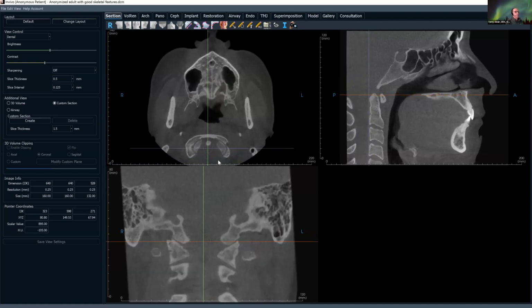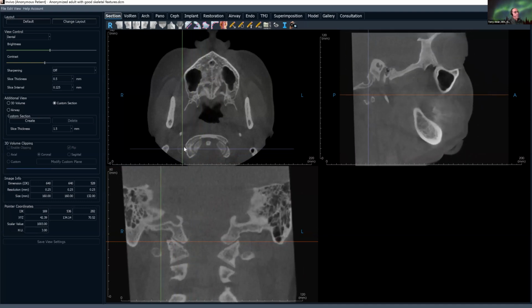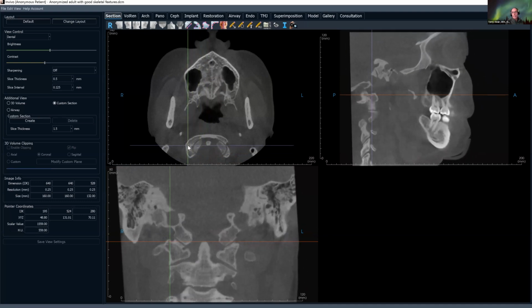And then one last look, I am going to grab these crosshairs just to the lateral side of the cervical spine. And right here, you can have ossification of this posterior loop of C1. And this is where you'll have a nerve and an artery. And if this loop gets calcified or ossified, then you may have impingement on that nerve, particularly if the patient turns his head.